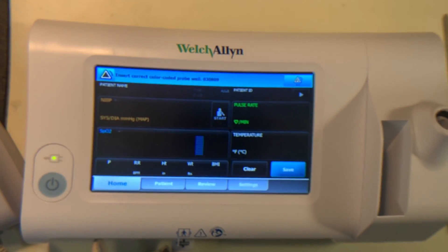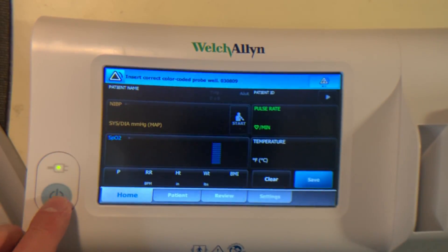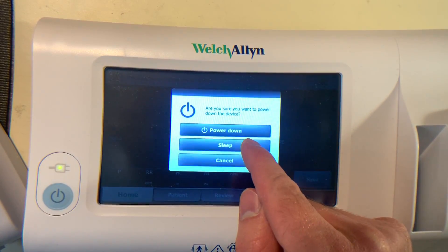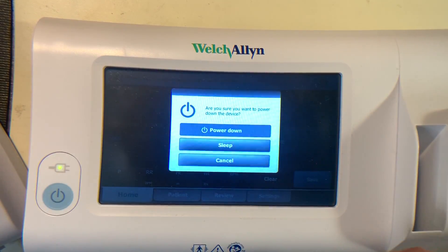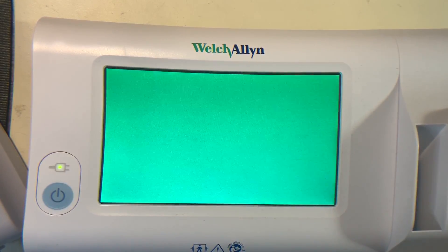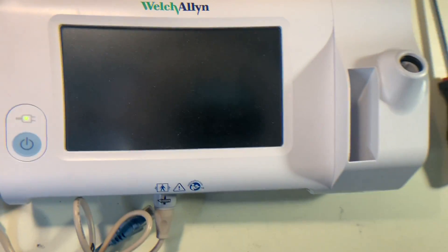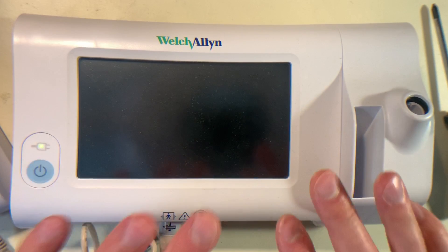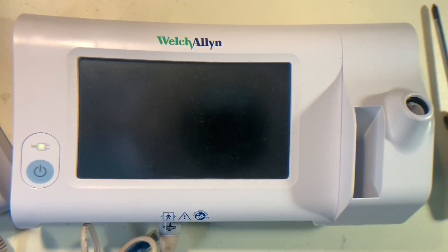To shut the unit down, just hold the power button down and you'll see a menu come up where you can either do sleep or you can do power down. Power down will show a green screen like this and then it'll turn off entirely. That's the basics — just a general overview of the device and how it operates.